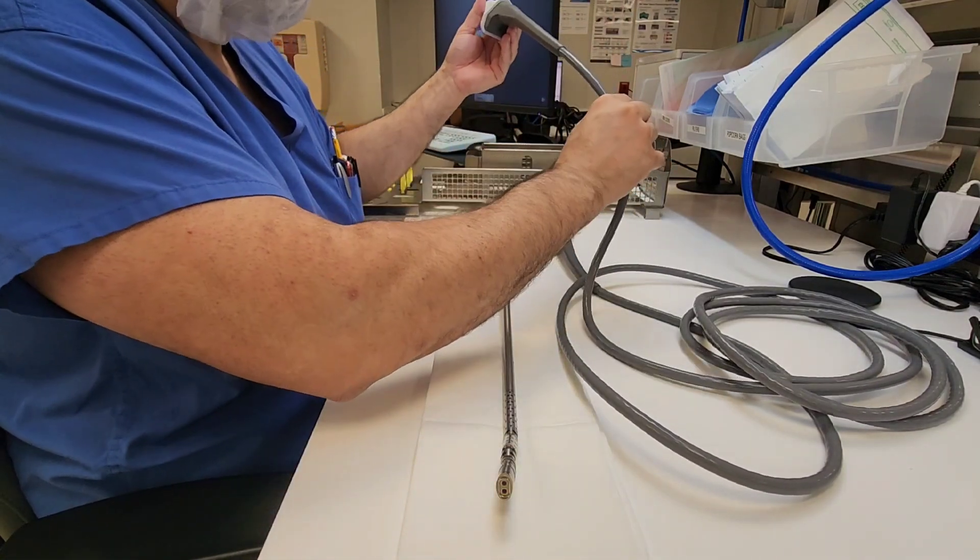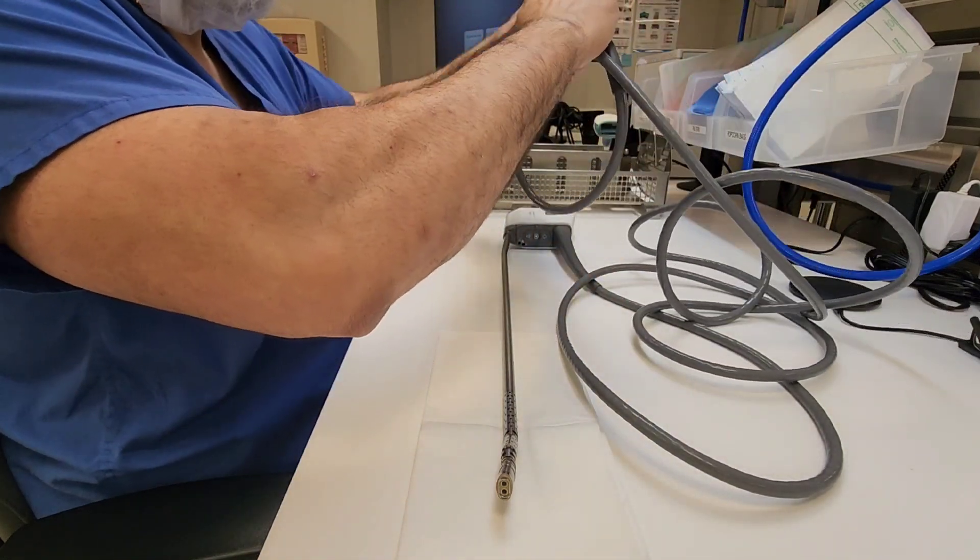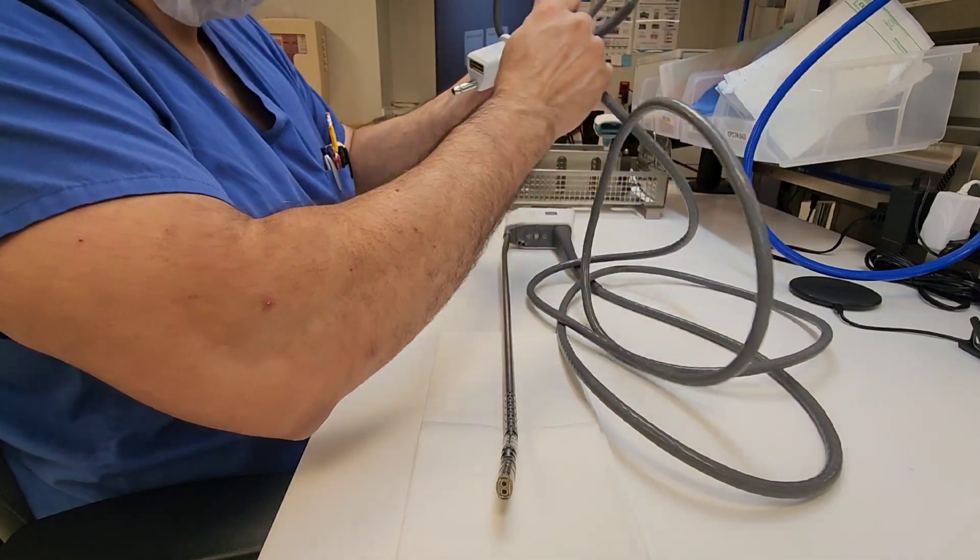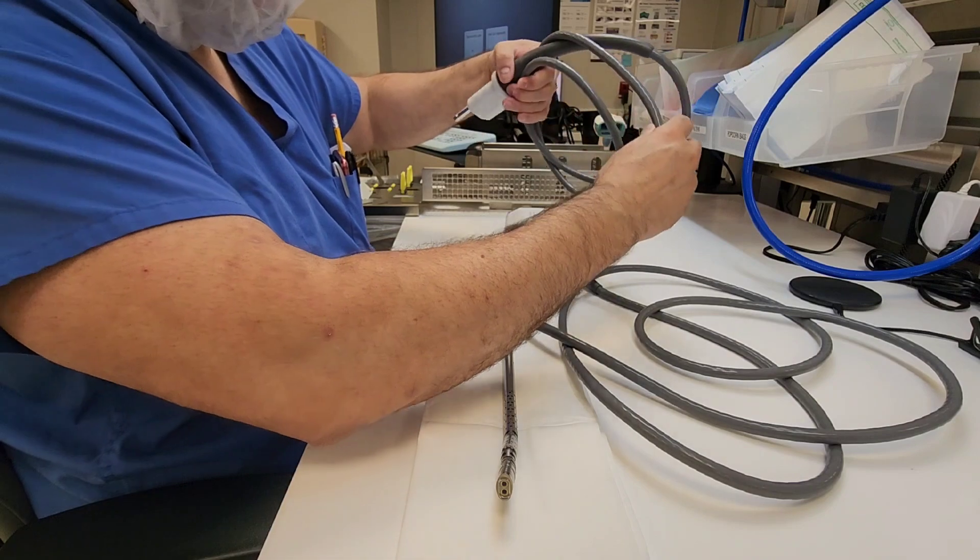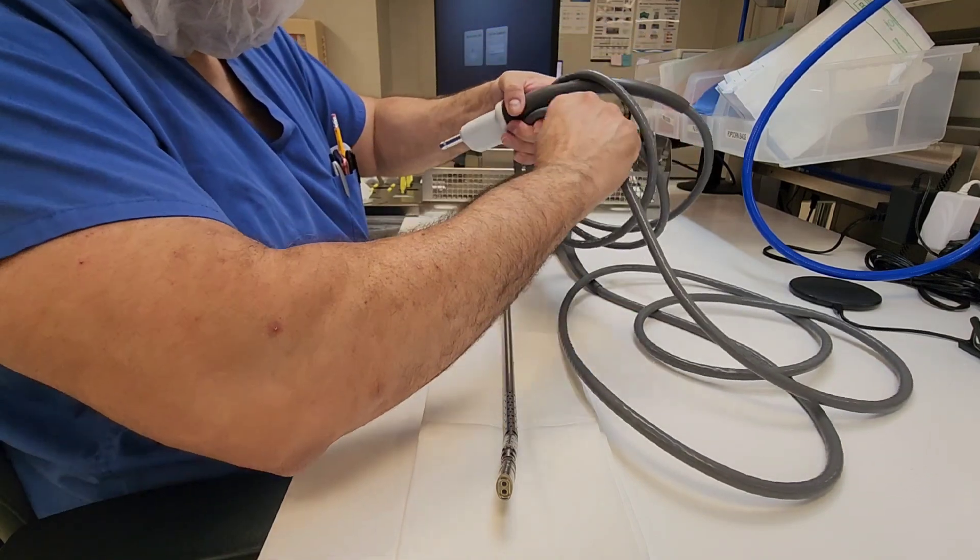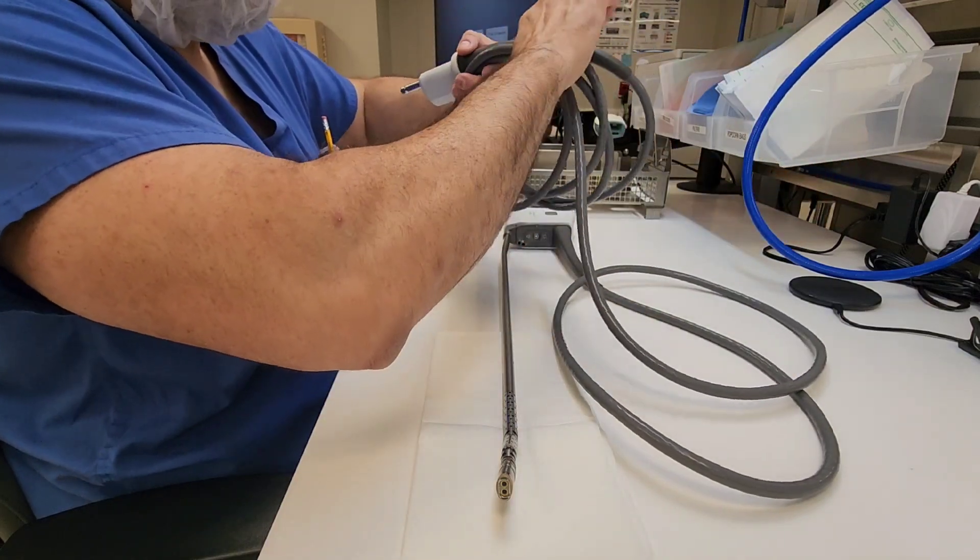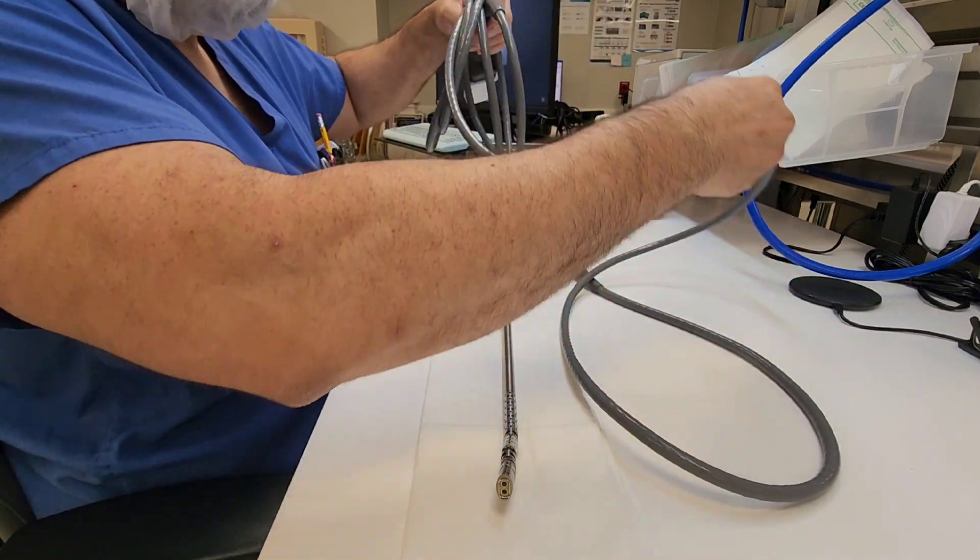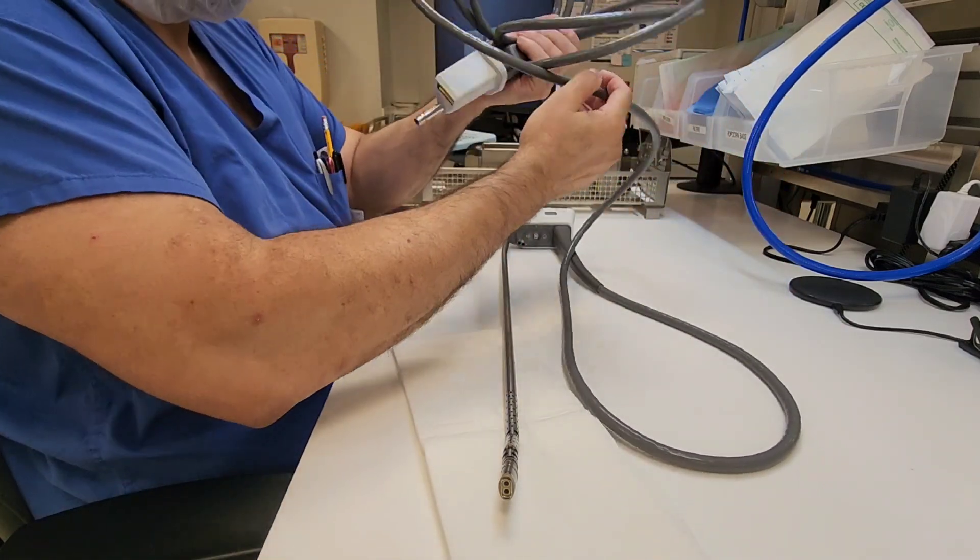The distal tip is inspected for any cracks or any kind of loose components that should not feel loose. After you've inspected and run your hand down that cord, you want to be neat about it and roll that cord up so that you don't have it interfering with the next steps of your process.